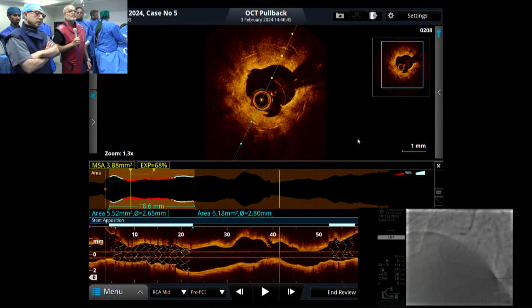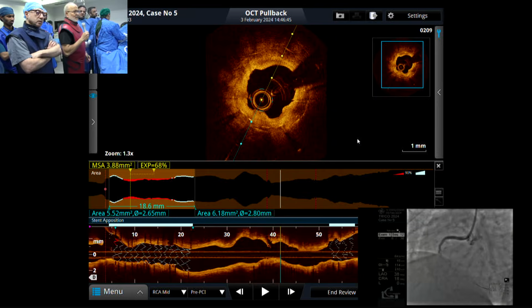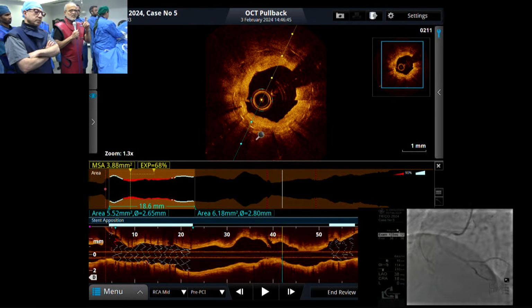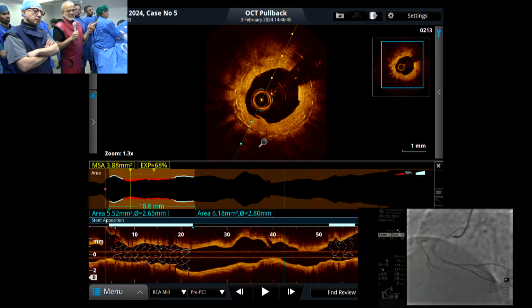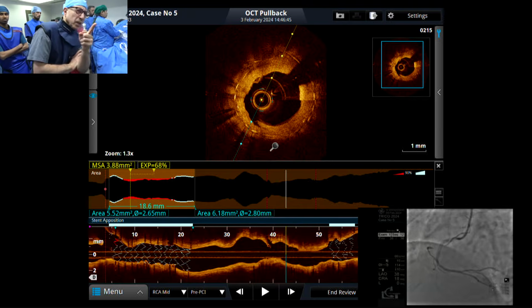So what will be the strategy to kill the ISR? We can restent. I tell you, we will stent it, I think. See, as per one Japanese study, and that too, again, Dr. Akasaka's work, they have shown significant restenosis.